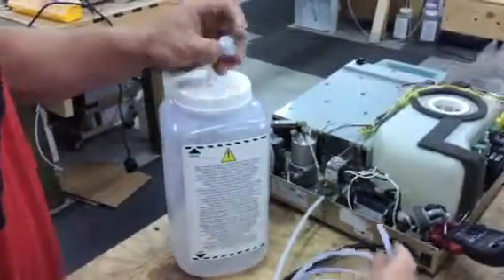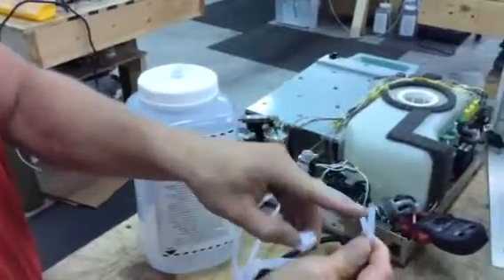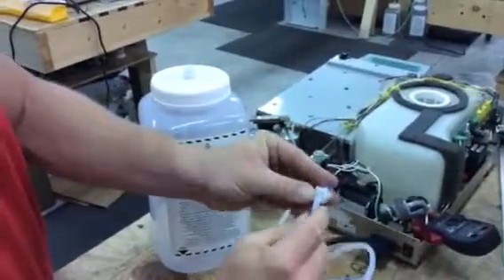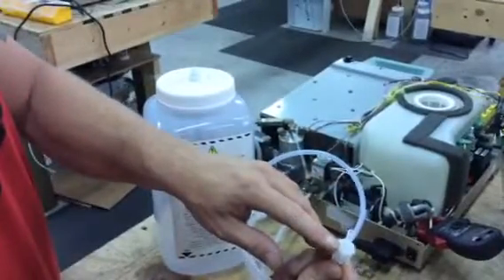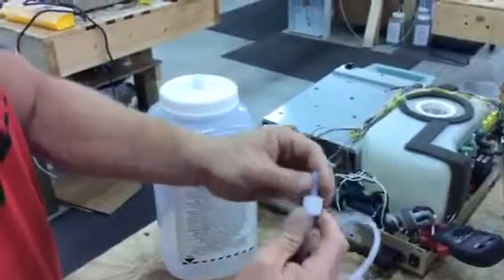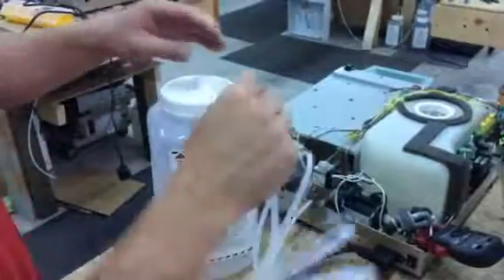From there, you unscrew it. You take the end of your tip here, make sure it's nice and round, and you push it in through here, and then it will lock into place where it's supposed to be.